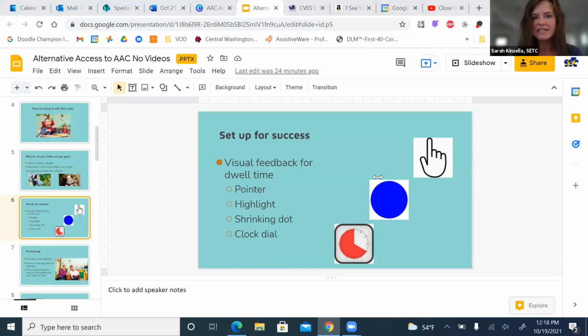The other question is, has anyone used the eye gaze devices from iTech? Great question. If anybody wants to comment on that. Looks like someone has. Ruth Ann says they were great. And I've tried it. Yeah, and I know someone who's using it with a few students and is really enjoying it. So iTech is another option. And what is the language system with iTech? It has multiple. So Ruth Ann, if you're able to share, what are you using with it?